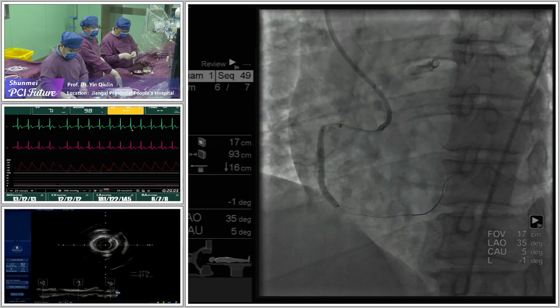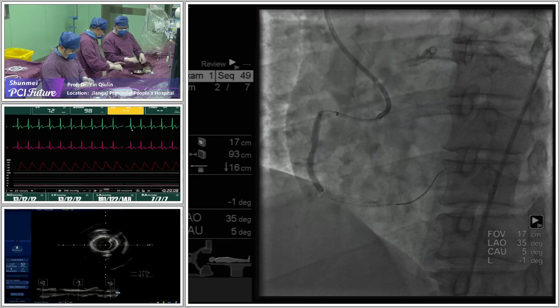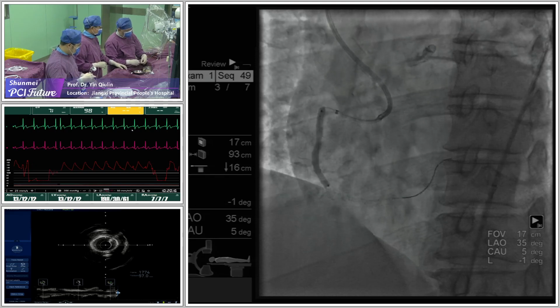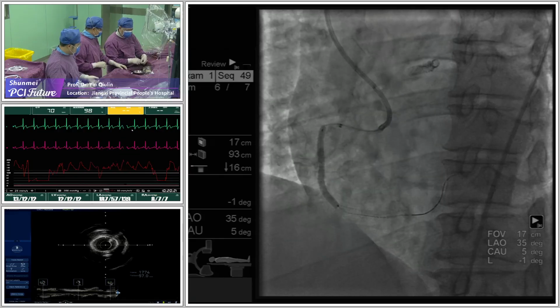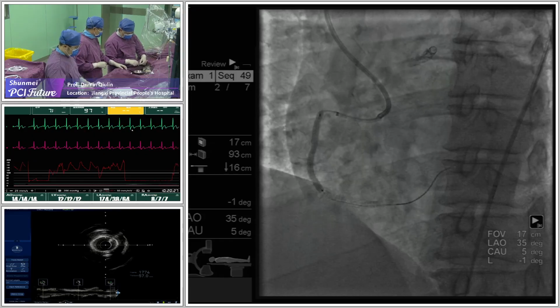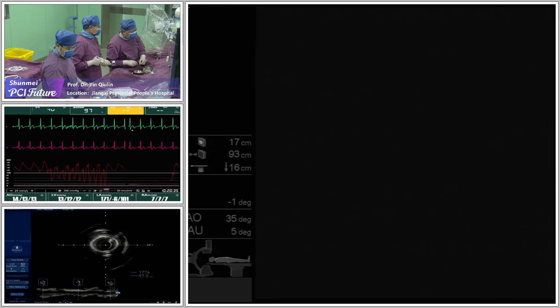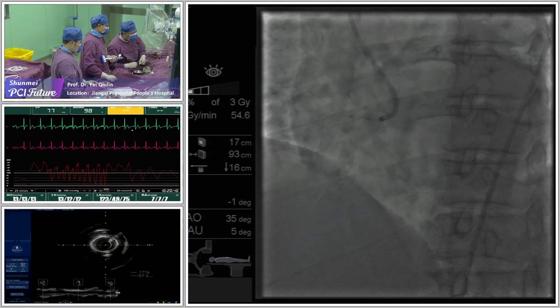Like we using cutting balloon first, or we check the IVUS first? 要根据不同的病变，因为这个病人全程支架，而且从支架的形态上来看，起的不是太理想。所以往往这种情况，我会先去后扩张，然后再去看 IVUS。如果病变不是那么长，也不是那么复杂的话，可以先去看 IVUS。特别是对一些短的病变。OK。In this case, we will try to do the post treatment, use the NC balloon first. Yeah.